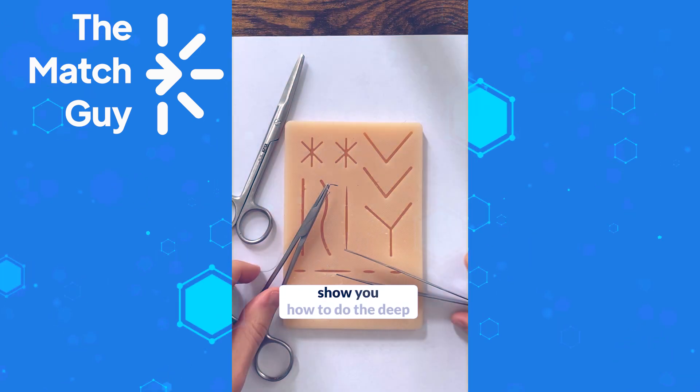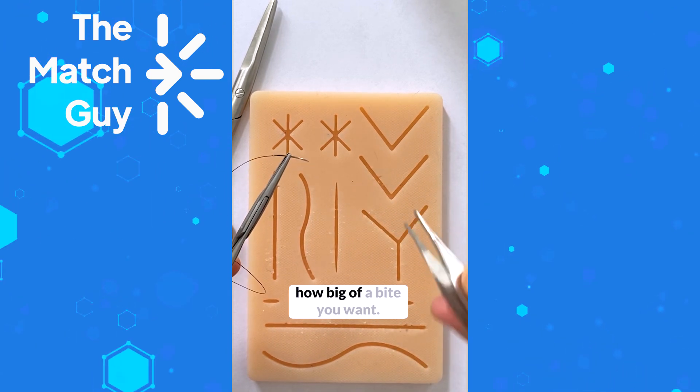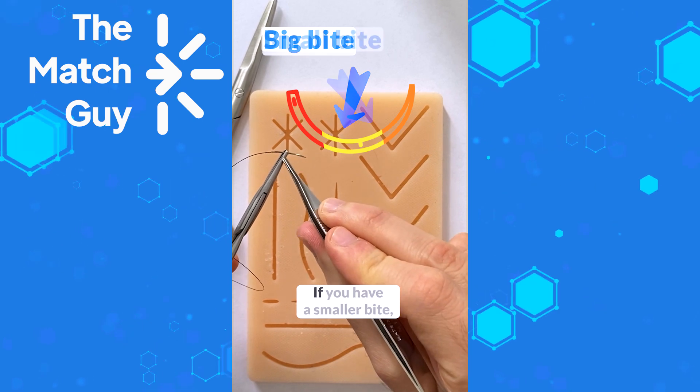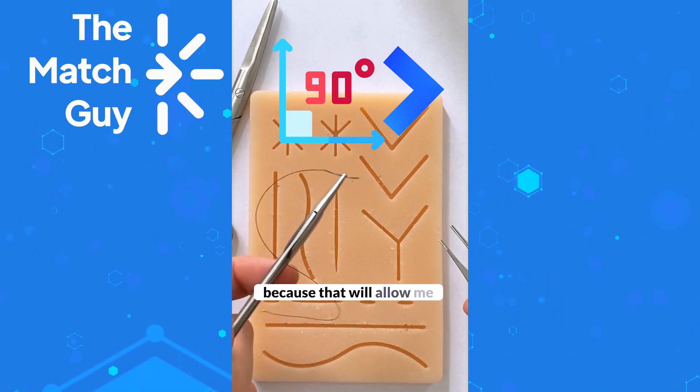Now I'm going to show you how to do the deep dermal suture, which is a very commonly used suture. You load your needle depending on how big of a bite you want. If you have a bigger bite, you load it further away from the tip. If you have a smaller bite, you load it closer to the tip. I usually load it at more than a 90 degree angle because that will allow me to place the needle easier.